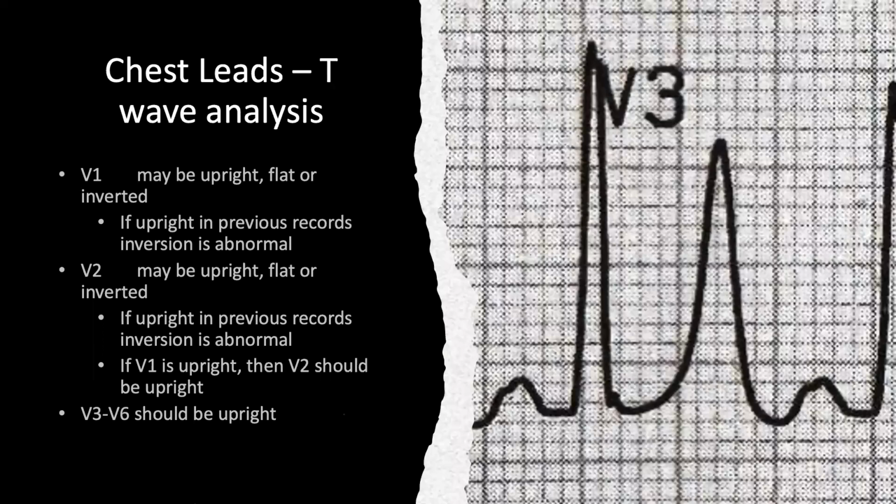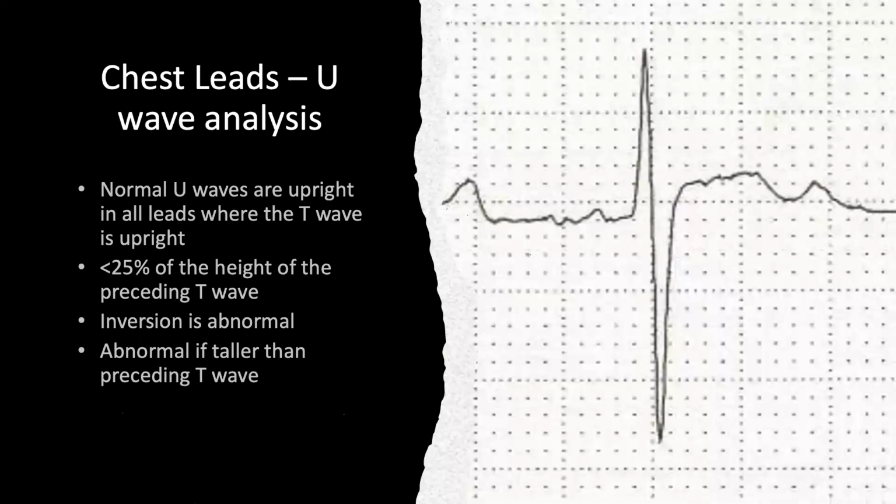U wave. Now the U wave might be new to you, but just bearing in mind the U wave does exist, and thinking about if it's inverted or if it's bigger than your T wave, what that might mean. And once or twice I've picked up a very low potassium, so a hypokalemia, because the ECG looked a bit funny, and those U waves were very present that you wouldn't ordinarily see otherwise.